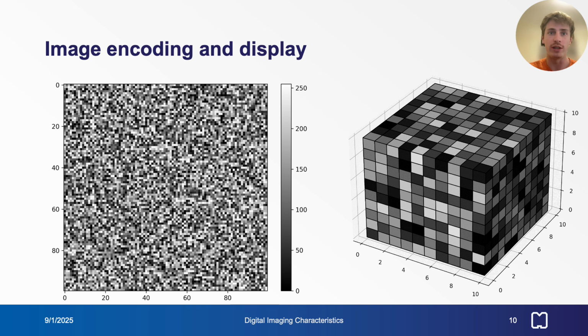Individual digital images typically consist of a 2D rectangular array of regularly sampled picture elements, also known as pixels, as shown on the left. When an image or frame consists of a cross-sectional slice through the body, then an additional dimension exists, normal to the plane of a slice. A pixel is then referred to as a volume element, or voxel, as shown on the right.